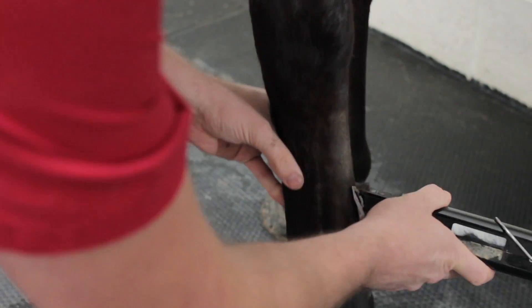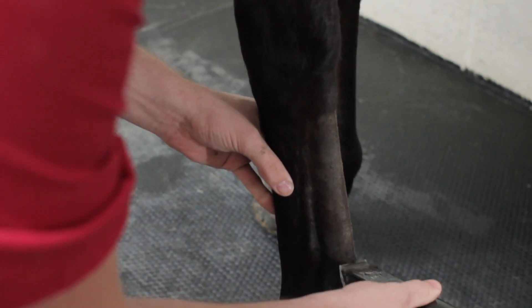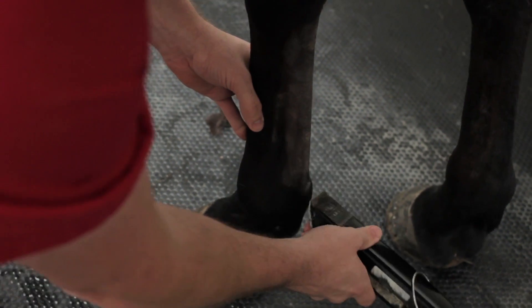It's quite important to get very good contact between the probe and the skin, and one of the main enemies to that is hair. If you want good ultrasound images, you're going to have to clip the hair. Bear in mind that owners often won't want you to do that, so make sure you have their permission, that they know which area you're clipping, how large that area will be, and that it may take some time for the hair to grow back.